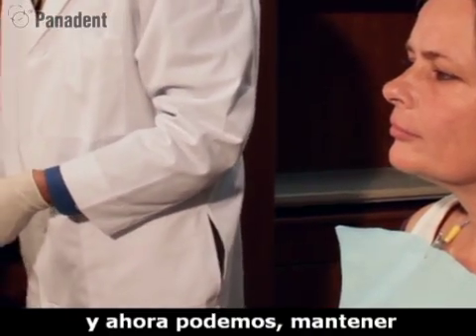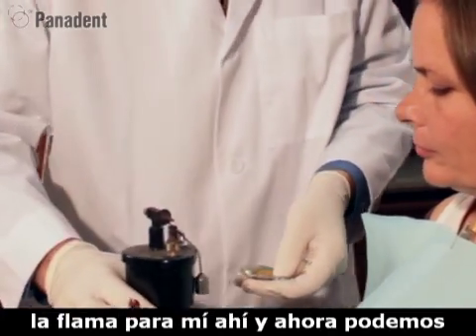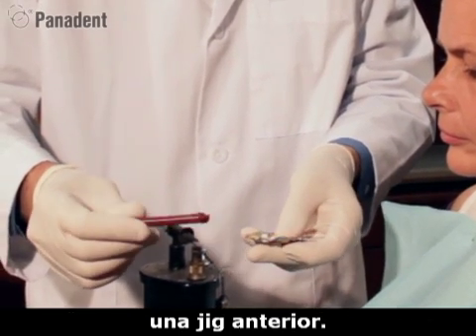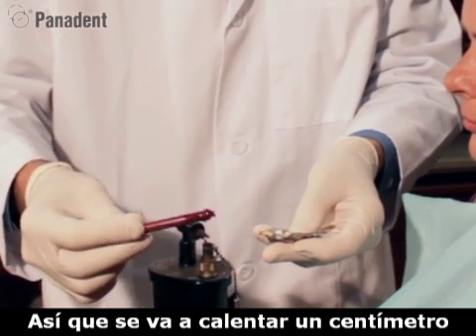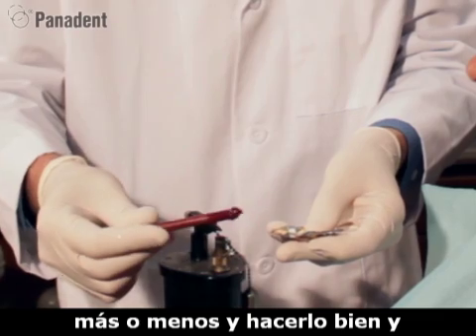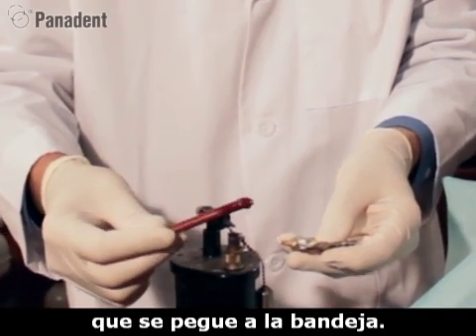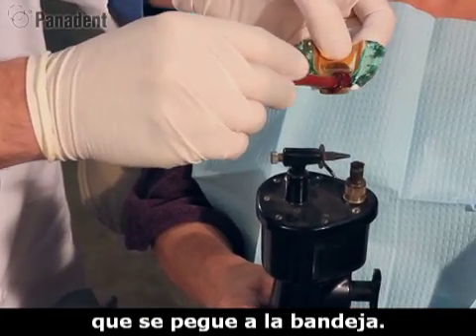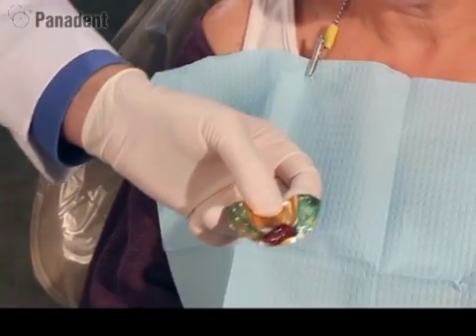And now we can actually, if you would just hold this torch for me right there, we can now heat some compound for an anterior jig. So we're going to heat up a nice big centimeter or so spot of this, get it nice and smoking hot so it'll stick to the tray real good. And then I get to where it's just slumping and we just get it all globbed right there in the front of the tray. Thank you.